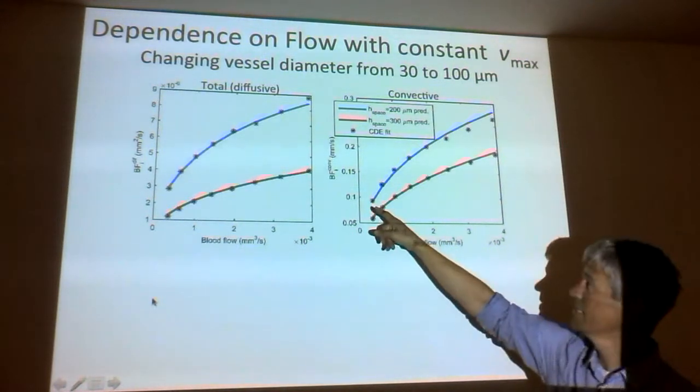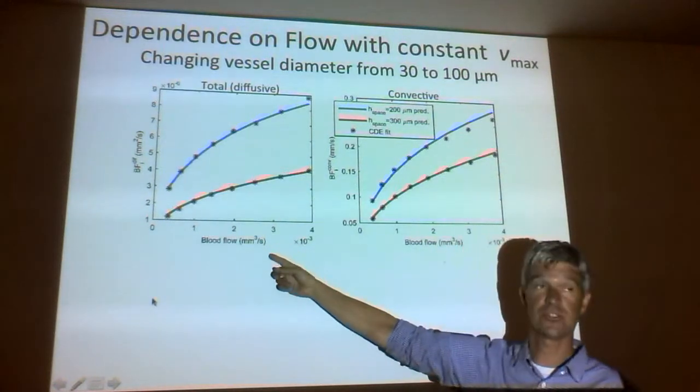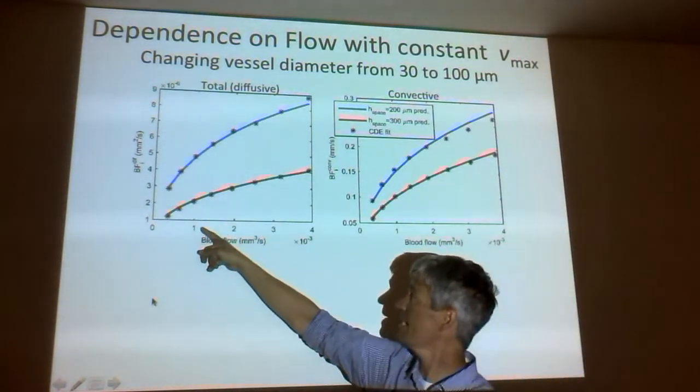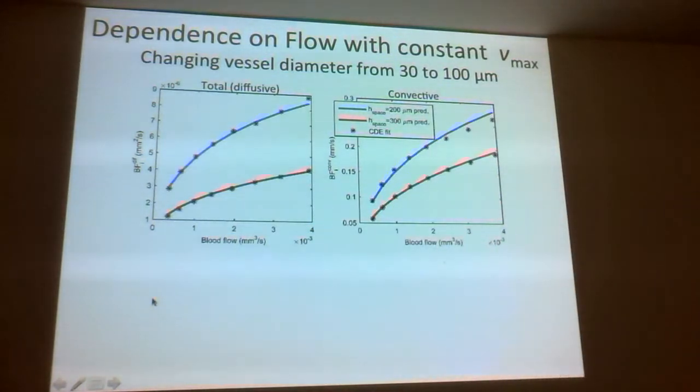So I'm plotting the blood flow index I get from the correlation function versus what the true blood flow is. And I see that as the true blood flow increases, I'm effectively underestimating it with DCS. So why is that, right?